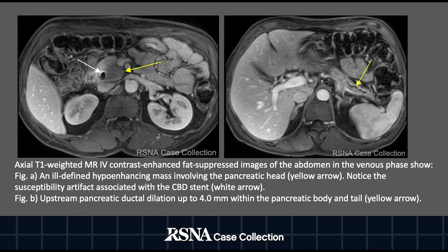Axial T1-weighted, MR IV contrast-enhanced, fat-suppressed images of the abdomen in the venous phase show, in figure A, an ill-defined hypoenhancing mass involving the pancreatic head, shown by the yellow arrow. Also notice the susceptibility artifact associated with the CBD stent, denoted by the white arrow. And in figure B, upstream pancreatic ductal dilation up to 4 mm within the pancreatic body and tail, shown by the yellow arrow.